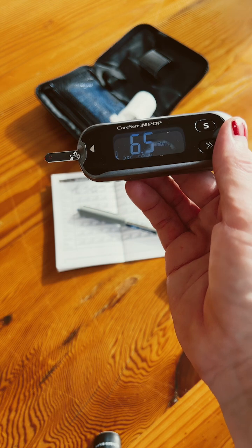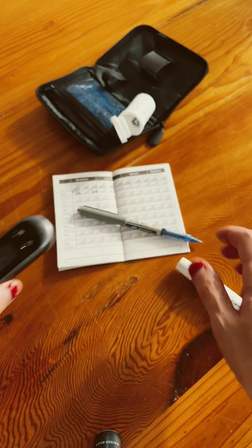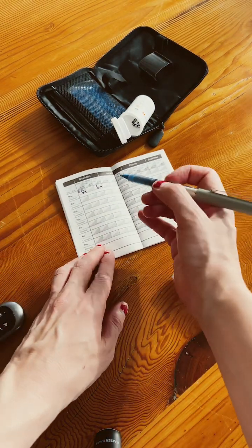Mine says 6.5, which is under target. If it's under 6.7 after a meal, that's good. Then you write the value down in your logbook.